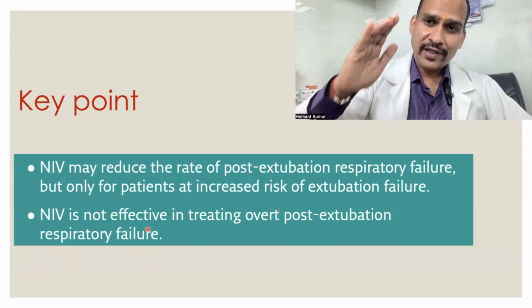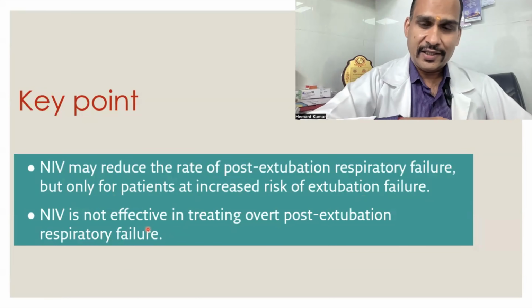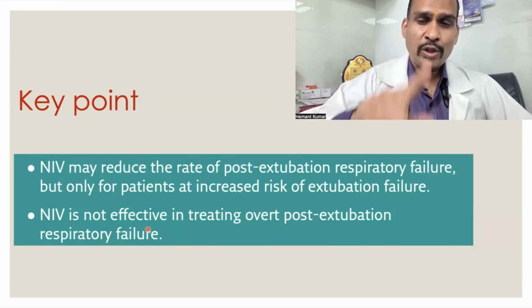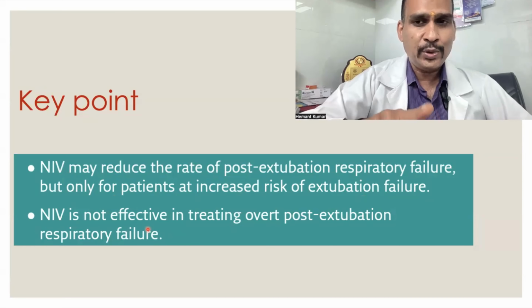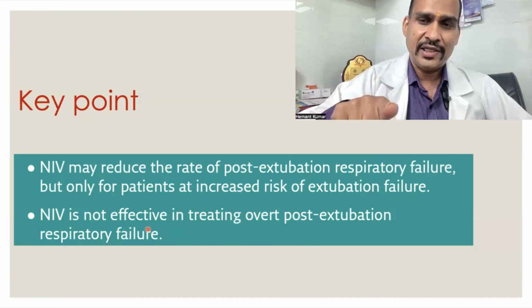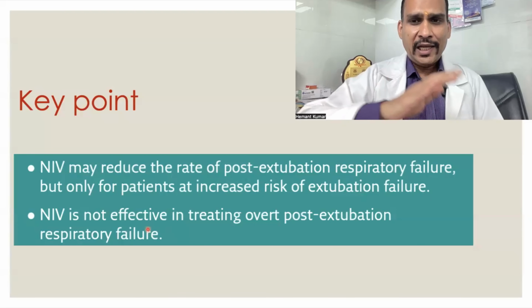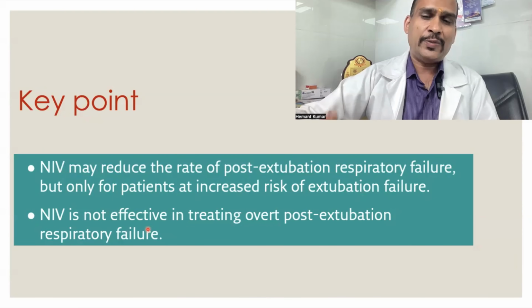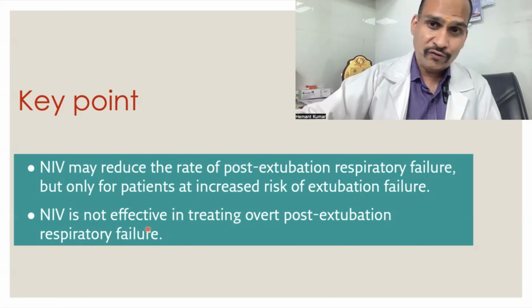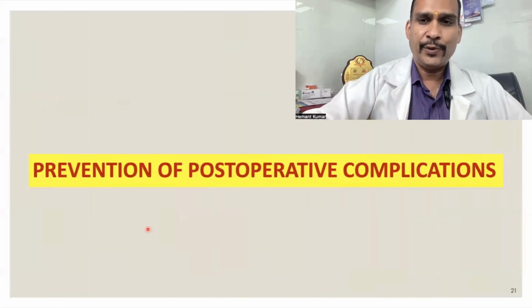It means after extubation, if the patient gets respiratory failure, then please don't apply NIV. You have to intubate the patient and keep on invasive mechanical ventilation. It will cause more harm if you apply NIV. So NIV is for prevention of post-extubation respiratory failure, not for treating respiratory failure. Keep in mind, very important point.